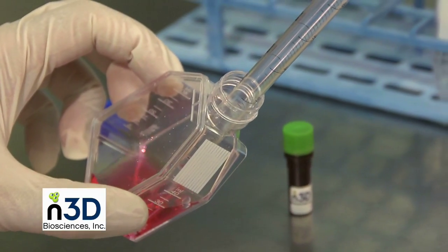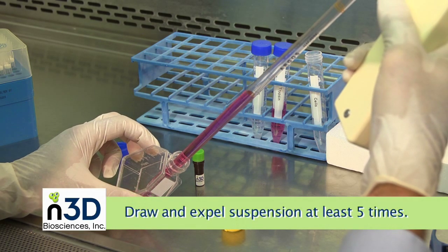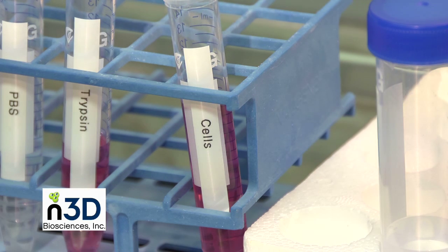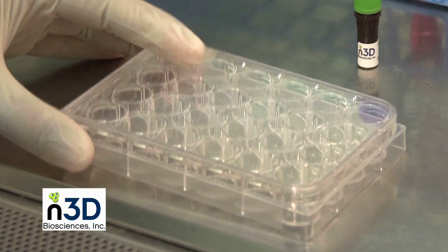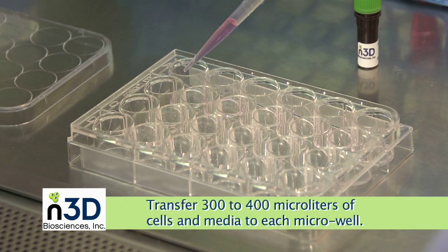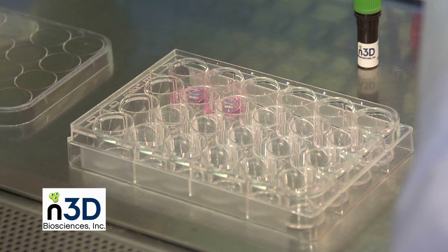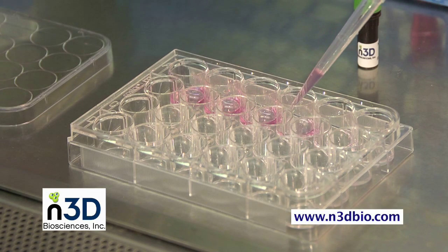Now draw the cell suspension with a sterile pipette. Expel the suspension back into the flask to rinse the inside surfaces. Repeat at least 5 times. Check again under a microscope to ensure the cells are in suspension. Redraw the entire cell suspension into the pipette. At this time, the cells should be counted. If needed, dilute or concentrate detached cells to obtain the desired cell concentration. Transfer 300 to 400 microliters of cells and media to each microwell. Depending on the cell properties and experiment, between 1,000 and 100,000 cells per well is optimum. We encourage you to experiment within this range to find your ideal cell number, such as performing a serial dilution of cells.